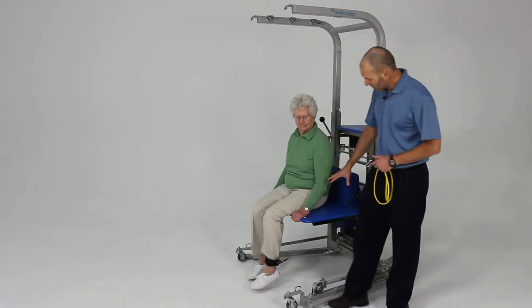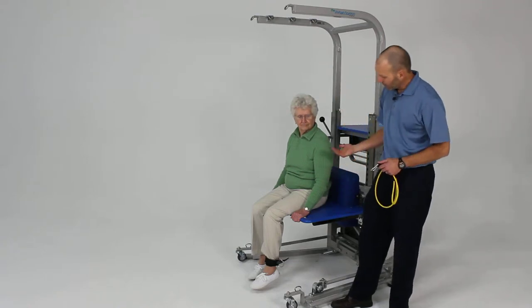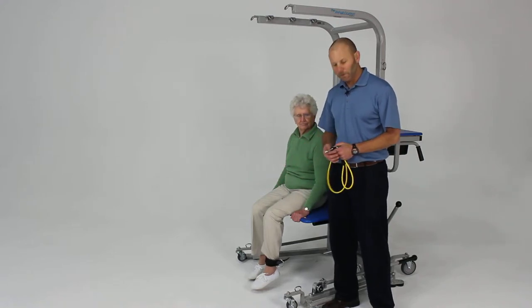The rehab station works well for doing seated knee extension. Using the bench attachment here, we can elevate that bench just enough so the foot is off the ground, so the person can swing their foot freely, which is difficult to do with a wheelchair and those kinds of things.